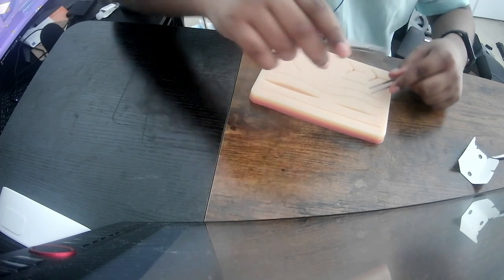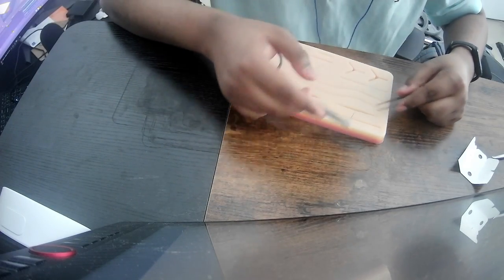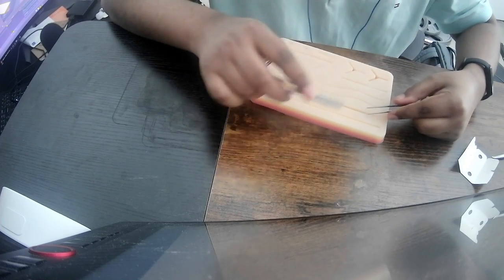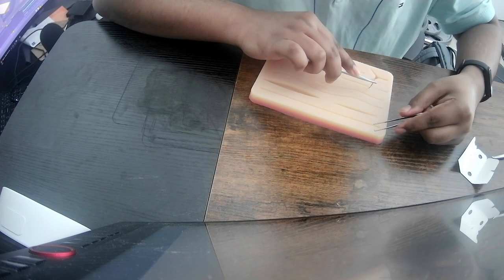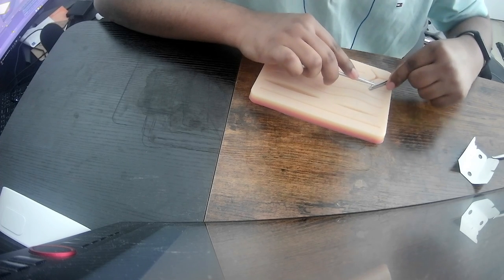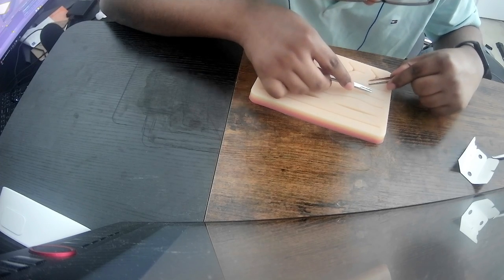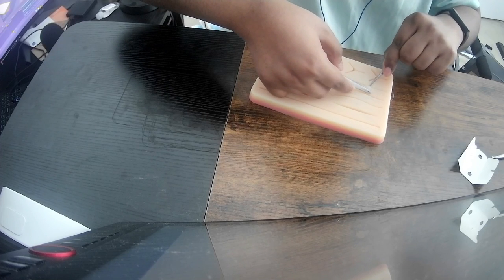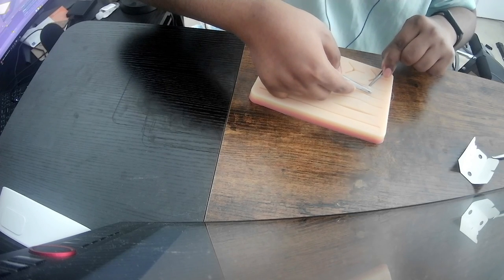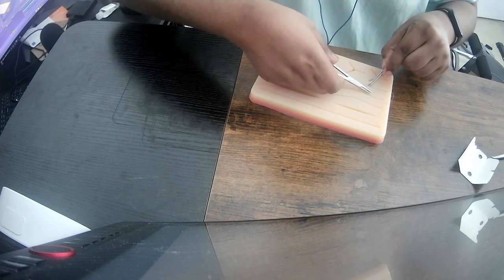Looks pretty good. Let's try again. I'll go through the whole line, basically, see how it works out. And then tomorrow I'll actually do simple interrupted sutures. Okay. Maybe I'll take one more day practicing just throwing. Let me try doing it in 2 bites. Oops. No, that's something you don't want to say in the ER.